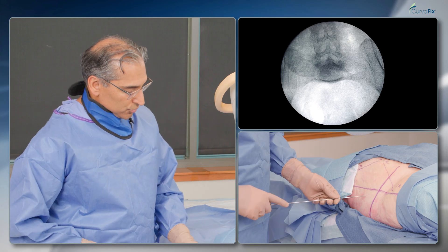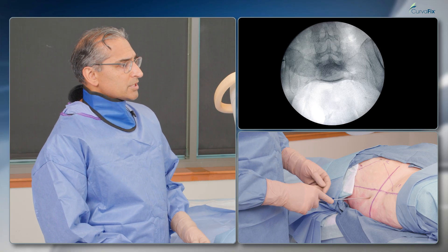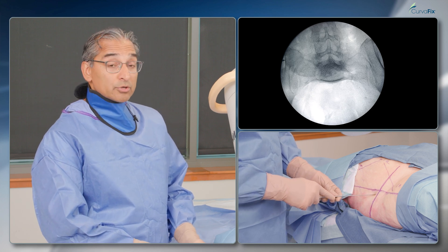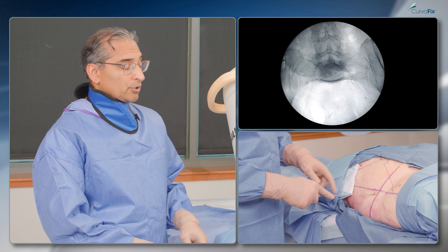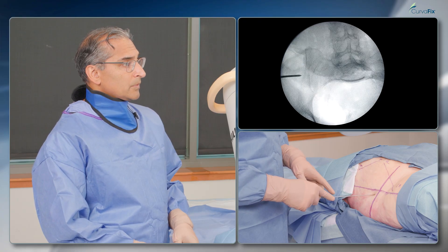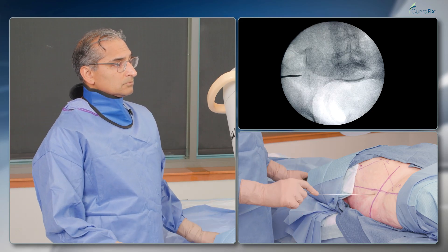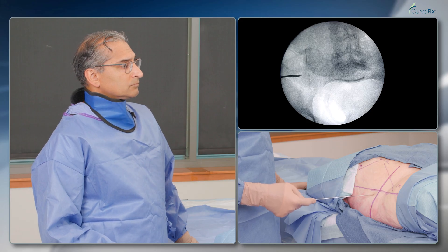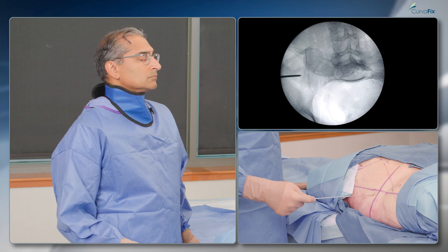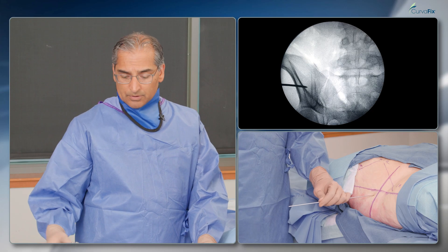I'm going to push in the posterior superior quadrant. That's two posteriors, so I'm going to start a little more anterior. Sometimes I'll do this with a 1.6 millimeter Kirschner wire to localize and then go in with the larger diameter wire. I like that starting point on both views.